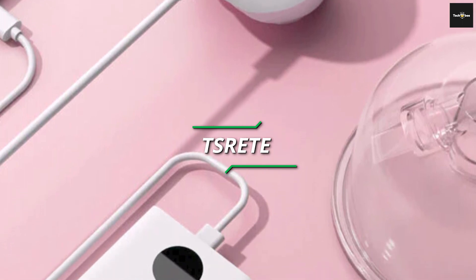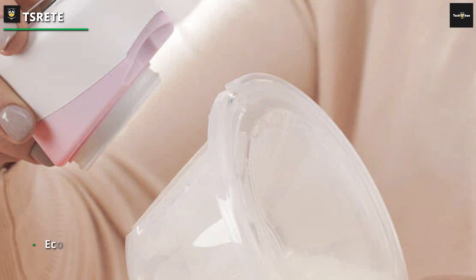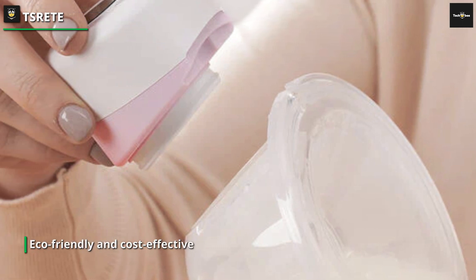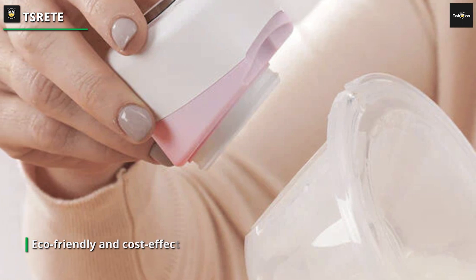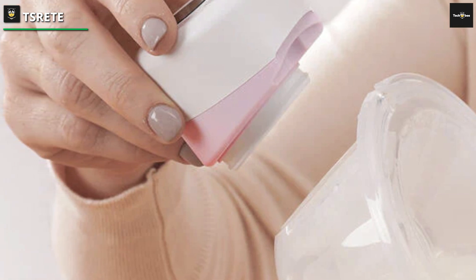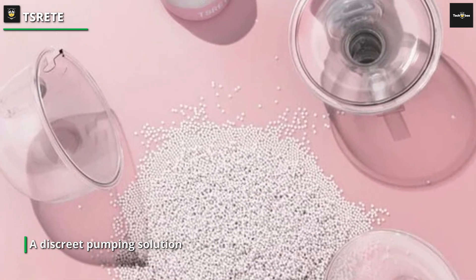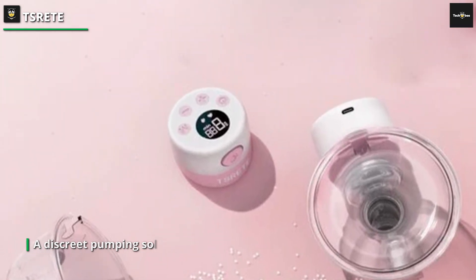The rechargeable feature eliminates the need for constant battery replacements, making it eco-friendly and cost-effective. Whether you're a multitasking mom or looking for a discreet pumping solution, the TSRETE Double Wearable Breast Pump offers the freedom and efficiency you desire. Simplify your breastfeeding journey with this innovative and user-friendly electric breast pump in a sleek and charming pink design.